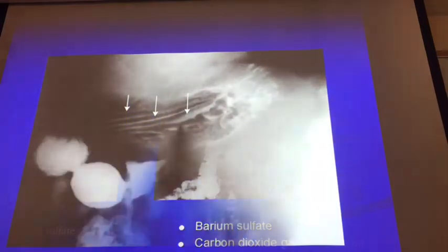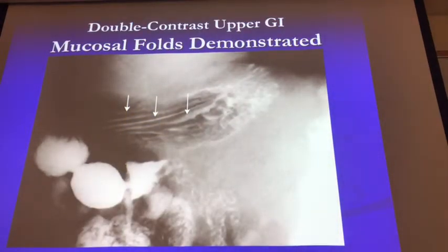Okay. Yeah. How do you mix it with air? We'll talk about it in just a bit. Okay. I'll just tell you now. Different ways. What most hospitals will do now, they will use sparkles. They will use seltzers. Well, they do blow up air when you take it in. Once you put it in, they just pop and they give you a bunch of air.